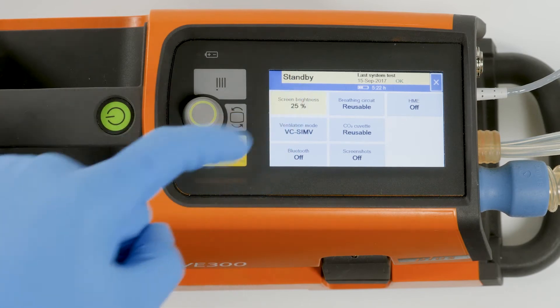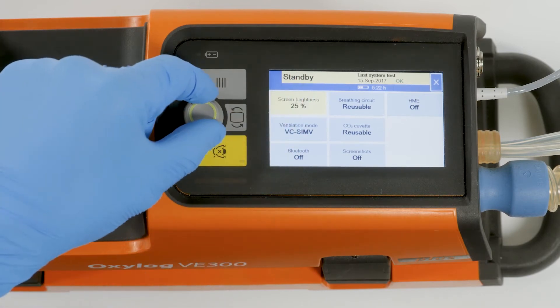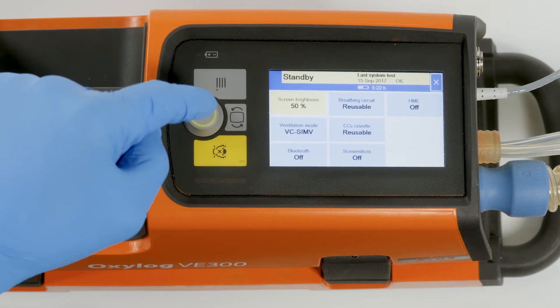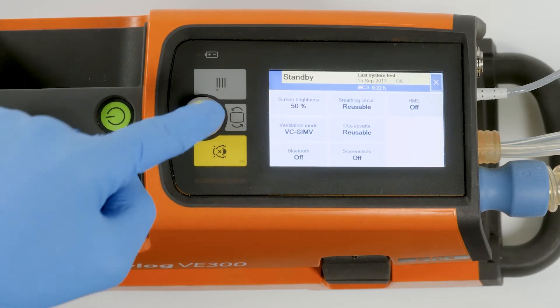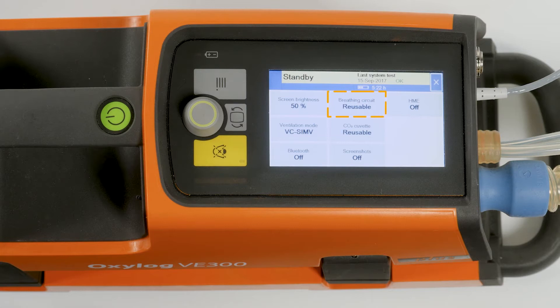The screen brightness can be set from 25 to 100%. To adjust the screen brightness, touch the Screen Brightness button, select the desired screen brightness, and confirm with the rotary knob. The breathing circuit can be set for the use of disposable or reusable breathing circuits.